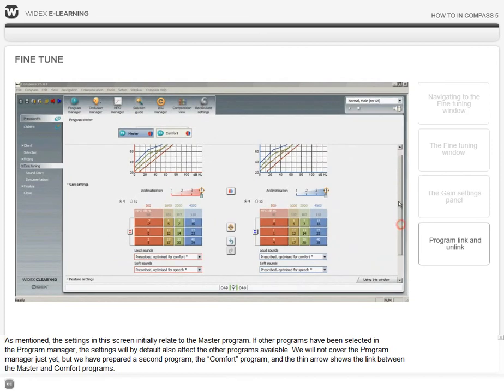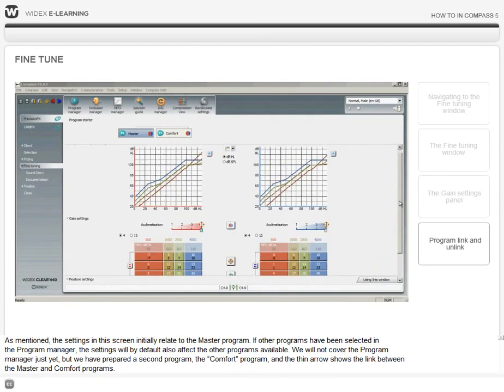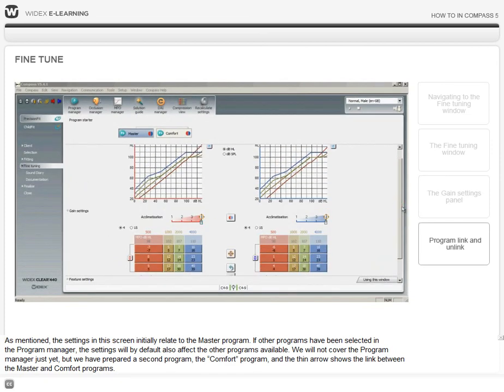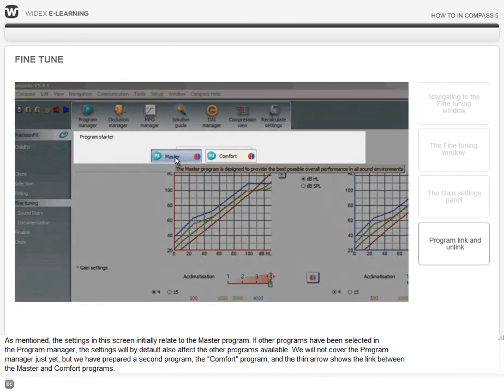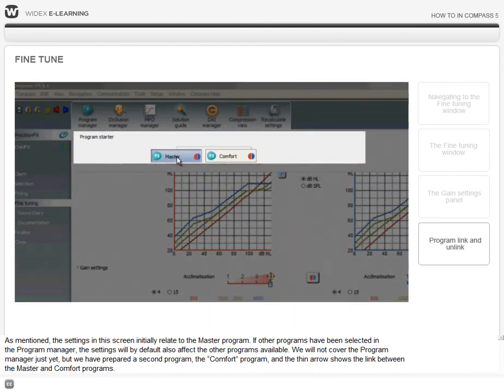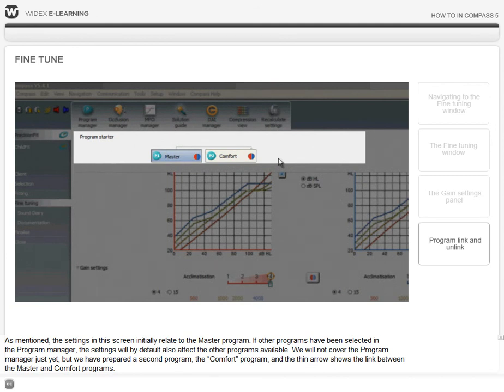As mentioned, the settings in this screen initially relate to the master program. If other programs have been selected in the program manager, the settings will by default also affect the other programs available.